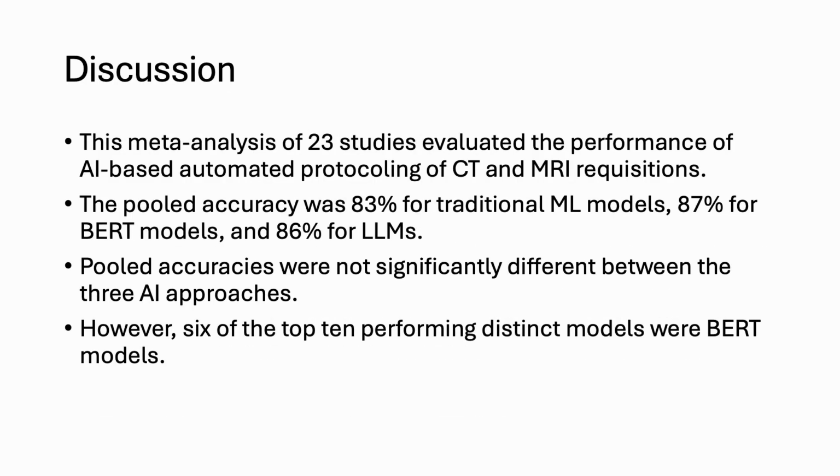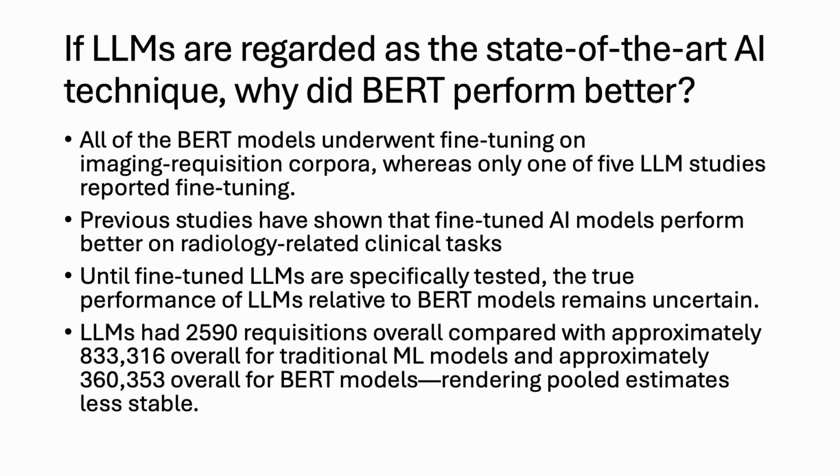So in conclusion, this is a meta-analysis of 23 studies evaluating the performance of AI-based automatic protocoling of CT and MRI requisitions. The pooled accuracy was 83% for traditional ML, 87% for BERT, and 86% for LLMs. There was no significant difference between the three approaches. However, 6 of the top 10 performing models were within the BERT category.